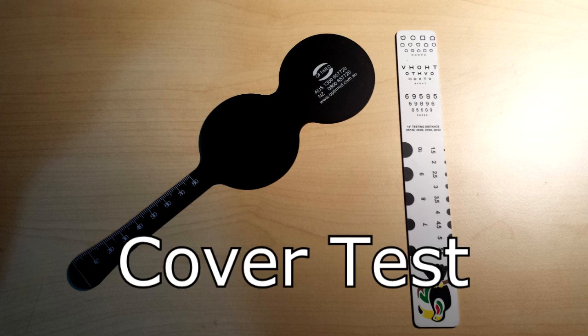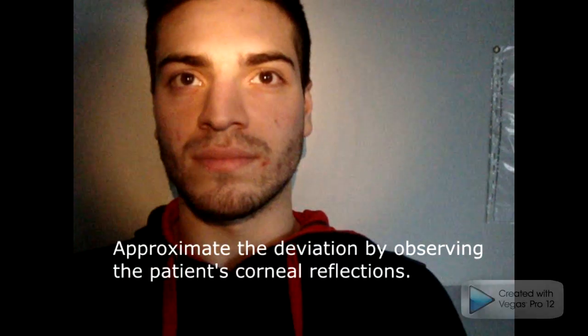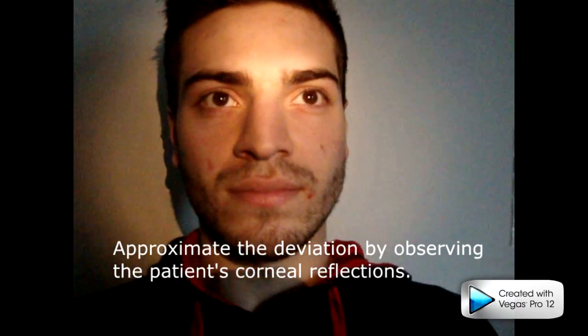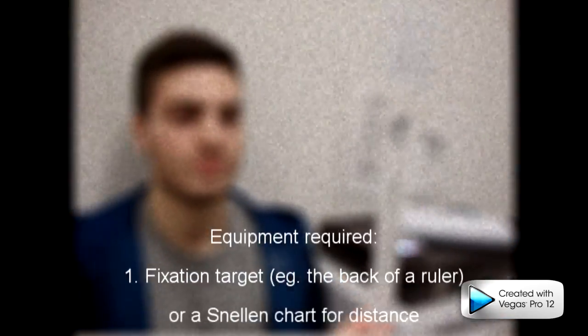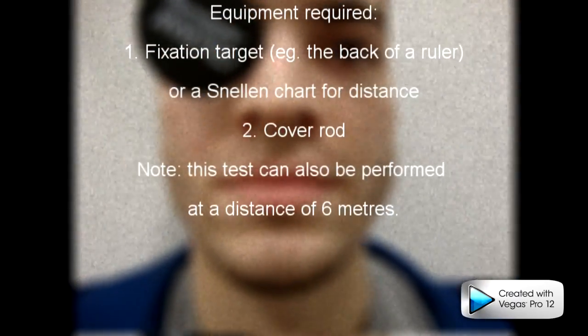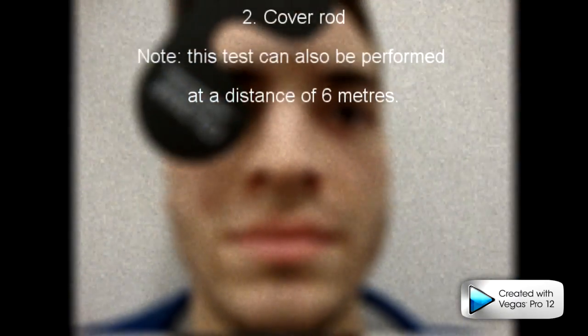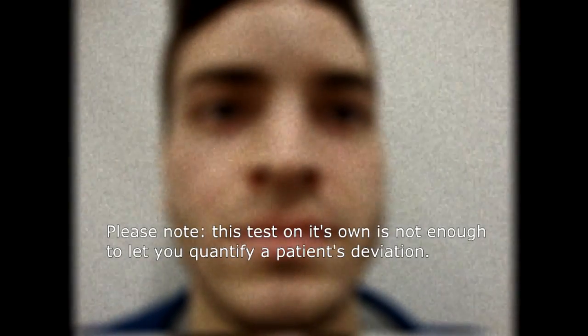Now performing the cover test. Before performing this test, you can do a Hirschberg test, which provides an approximate estimate of the deviation size if it's manifest. Cover test is an objective test used to detect and diagnose a type of deviation in a patient with strabismus. To perform the test, you need an appropriate fixation target at near and distance and an adequate cover. This test could be performed for near, which is 1/3 of a metre, and at distance, 6 metres.